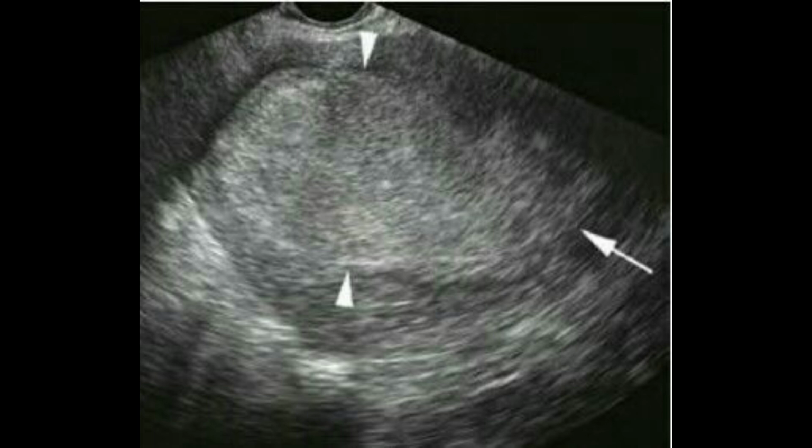You can see it at the arrowhead of the posterior wall. So with this, we came to an end of this episode. In the next episode, I'm going to cover the ovarian pathologies, and in the same manner as I have done in this episode, I will keep myself confined to the basic practical points which we see in our routine clinical practice.